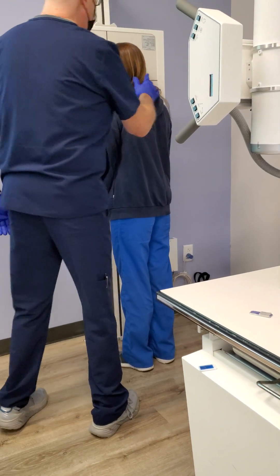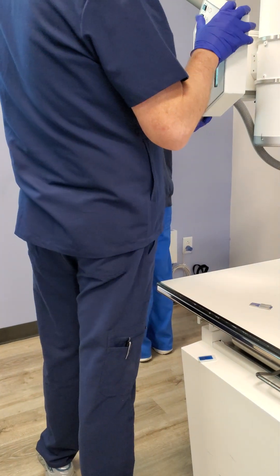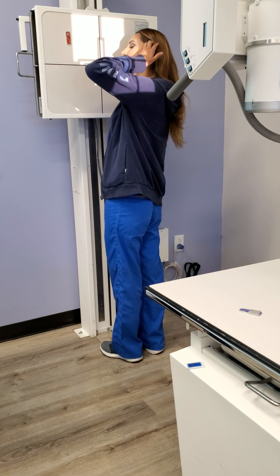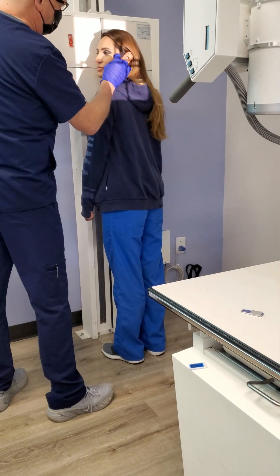Go ahead and turn your head all the way to the right. Since you're ready for this one, guys — it needs to be where for the facial bones? At the side. Put your hair back. All right, so Zygoma is going to be right here.